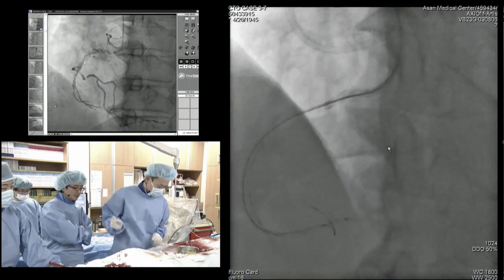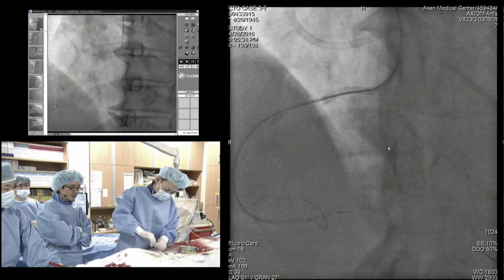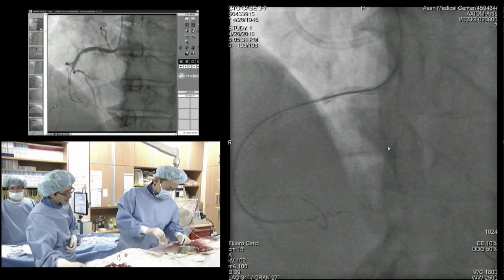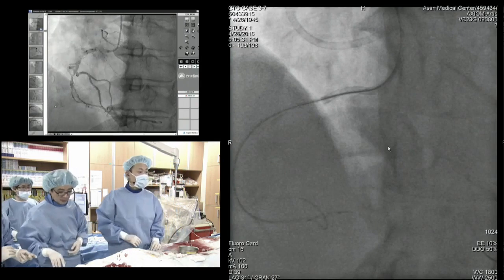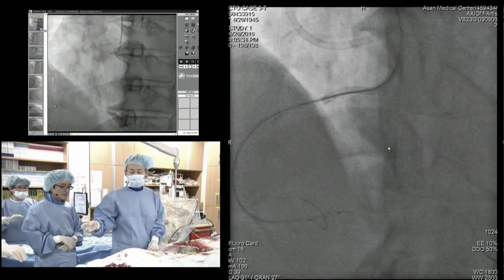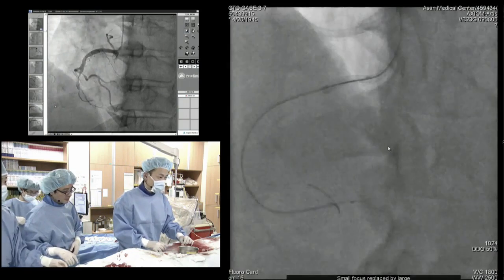It will be better to dilate, like with a 2.0 balloon. The proximal, yes. I tried, I dilated with the 2 balloon. Or before we dilate with 2.0, is it possible to see IVUS at this point? Can the IVUS pass? I already have the IVUS, so I tried the IVUS before balloon dilatation.